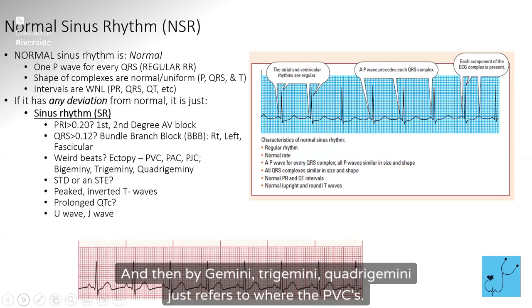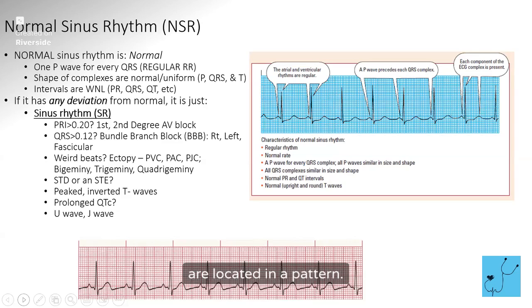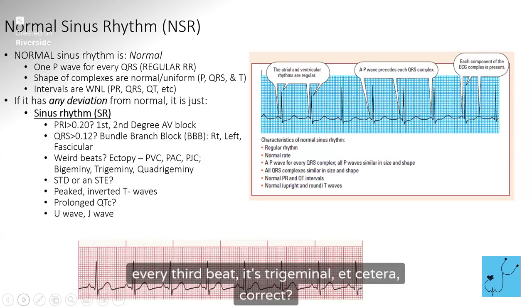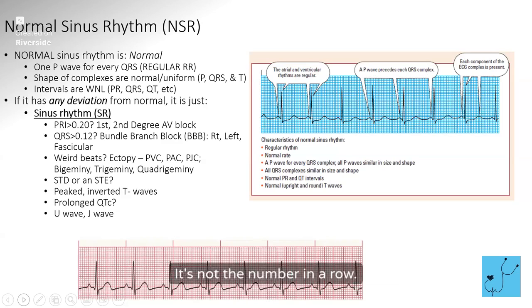And then bigeminy, trigeminy, quadrigeminy just refers to where the PVCs are located in a pattern. So if every other beat or every second beat is a PVC, you have bigeminy. If it's every third beat, it's trigeminy, etc. Okay. It's not the number in a row. It's where it's placed in the rhythm.